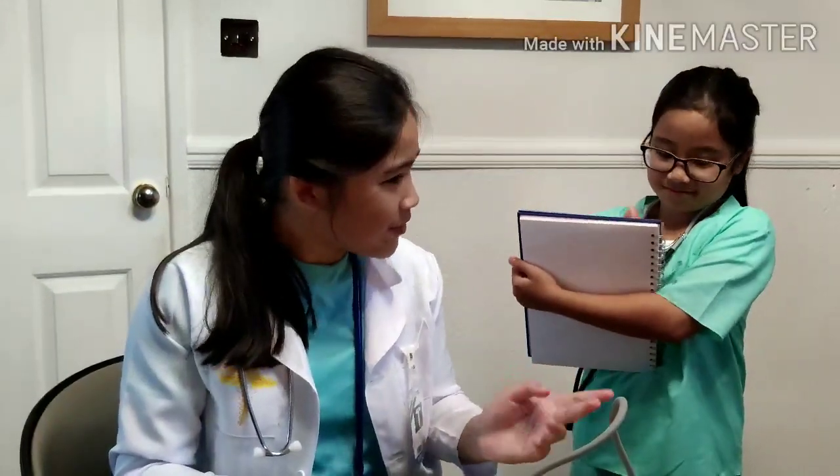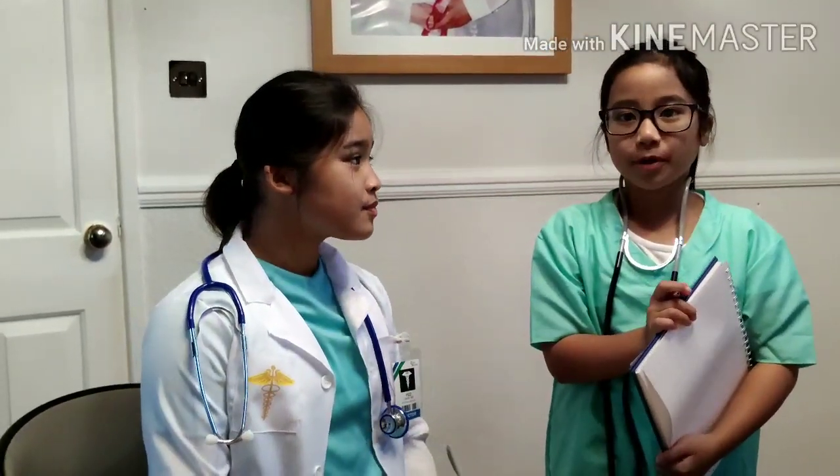Make sure to note it down. We couldn't include our patient's results because we have to protect our patient's identity.